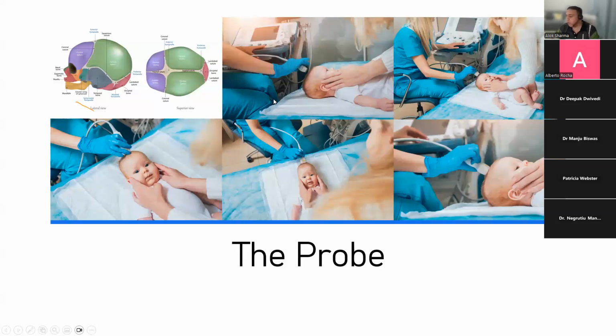The advantage of holding the probe, as I've described, is that when you have the baby and the baby moves, it's very difficult if you have anterior posterior motion to control the probe. On the other hand, if you have the probe side to side with your fingers supporting it on the right hand side, then really you can control, you can keep one finger on the fontanelle so that you know that you're still on the fontanelle. And if the baby moves, really you're altering your probe in relation to that. So there's some benefits in being able to learn that way.